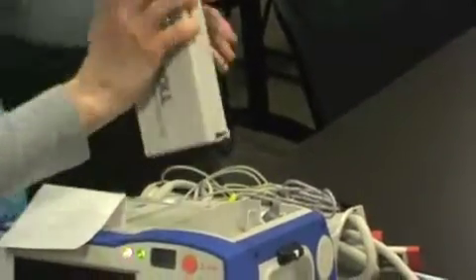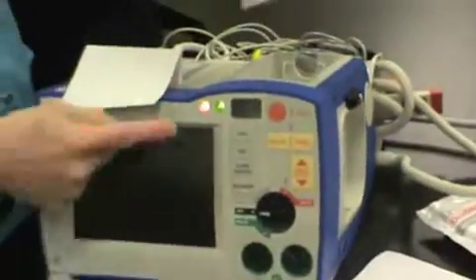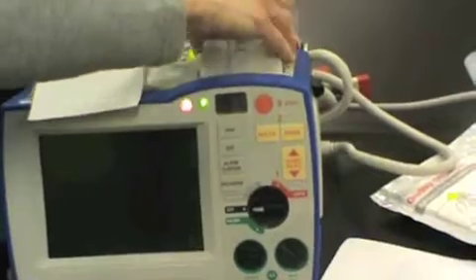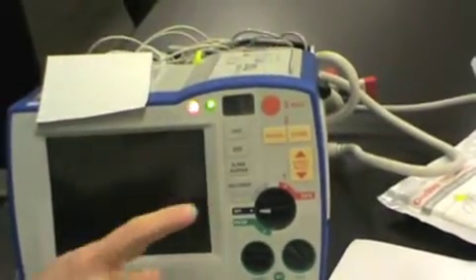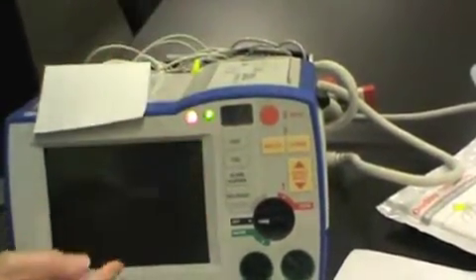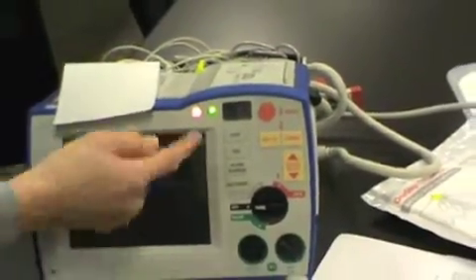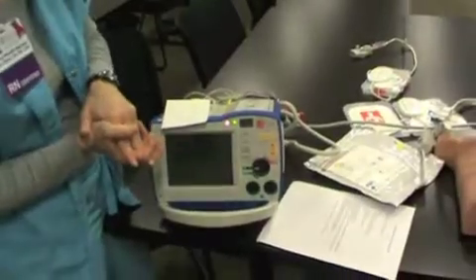You'll notice on the front here, you'll have these lights. It's blinking right now to tell me that my battery's not in. So I will put it back in to make it happy. You see this green one is telling us it's plugged into the wall. This now is yellow because it's charging. It'll turn green when it's fully charged.